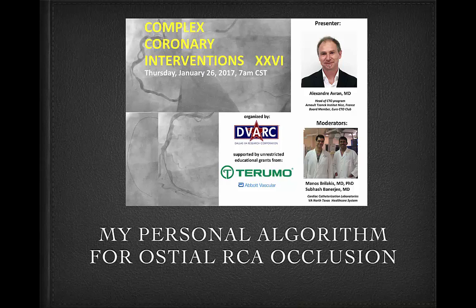And Manos, as I know that you are a great fan of algorithms, I created one, my personal algorithm for ostial RCA occlusion, and then I will show you with several cases how it fits.